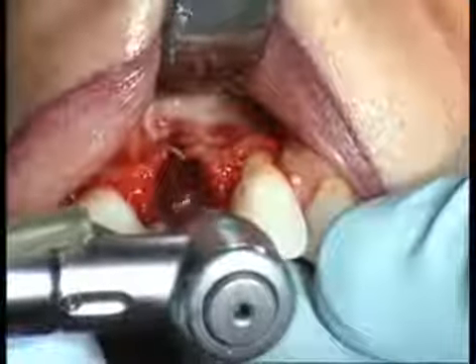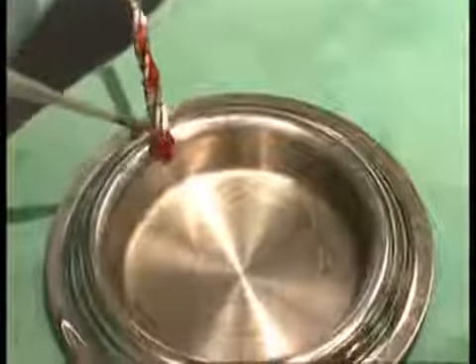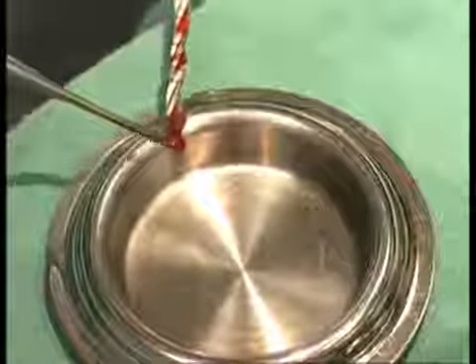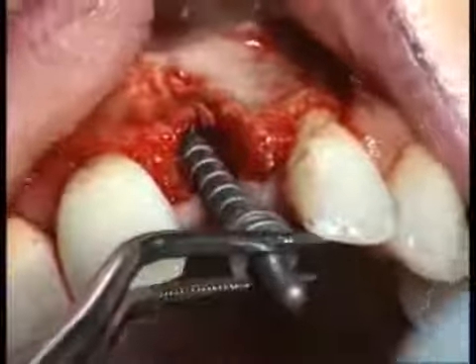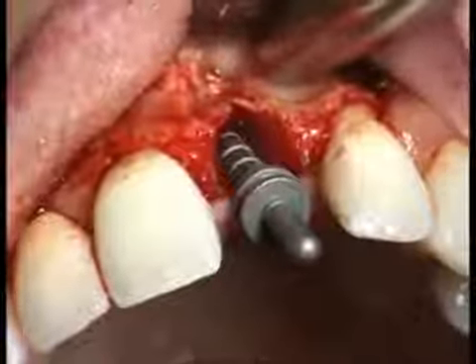The 2.8 mm pilot drill extends the implant bed. Spongeous bone shavings are carefully removed from the grooves of the twist drill and collected. The depth of the preparation is checked with the depth gauge.